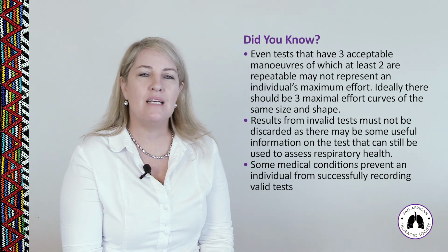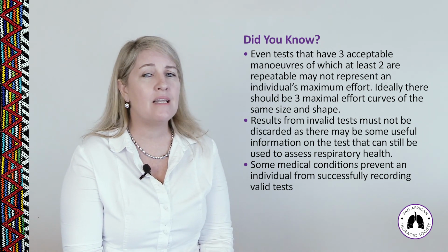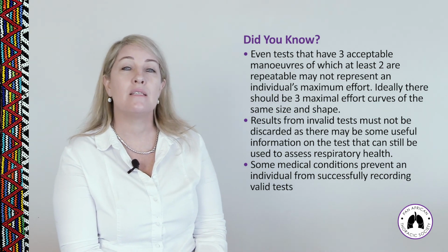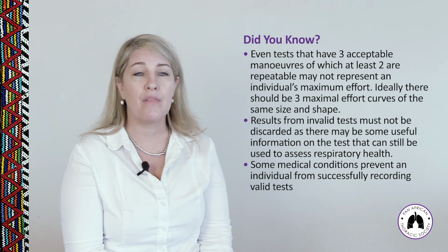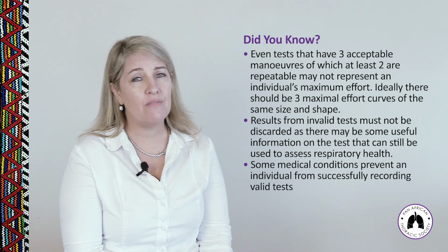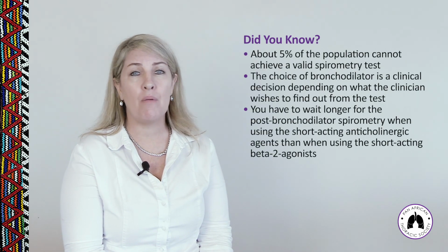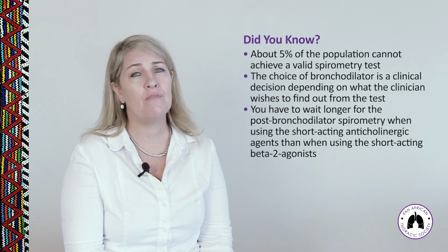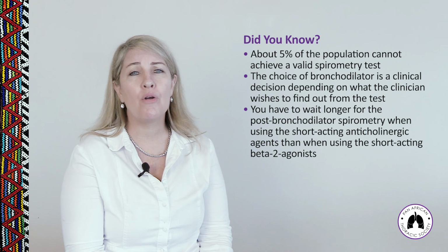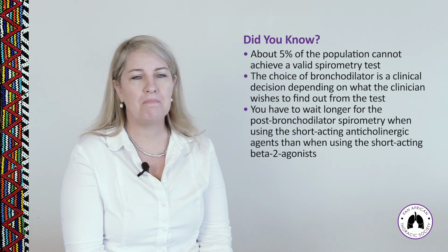Results from invalid tests must not be discarded, as there may be some useful information on the test that can still be used to assess that patient's respiratory health. Some medical conditions prevent an individual from successfully recording valid tests, and about 5% of the population really struggle to give you a good blow. So you will have some failure in your testing program, but hopefully not too much.